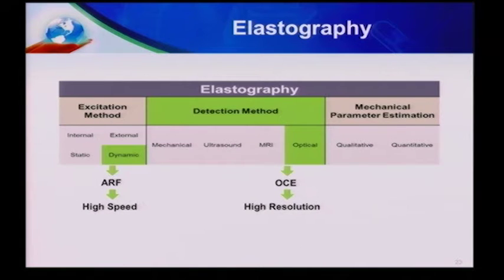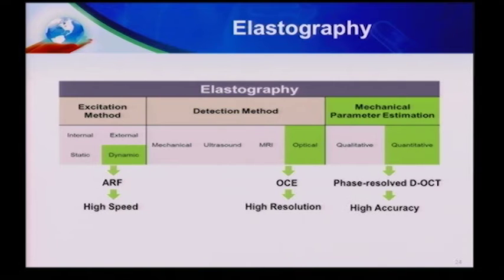Then we want to be able to detect that displacement at extremely high resolution. We want nanometer or sub-micron resolution, because when you have a plaque, you want to apply as minimal force as possible. Otherwise, if the plaque is unstable, you apply the force and it ruptures. That's not good for a diagnostic technique. So we want to be able to image very small displacement induced by acoustic radiation force.